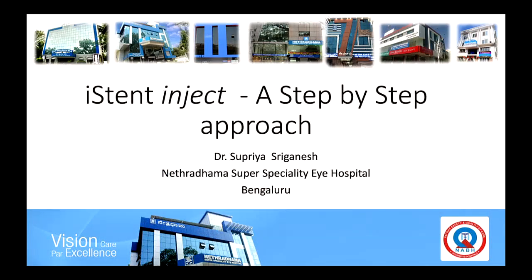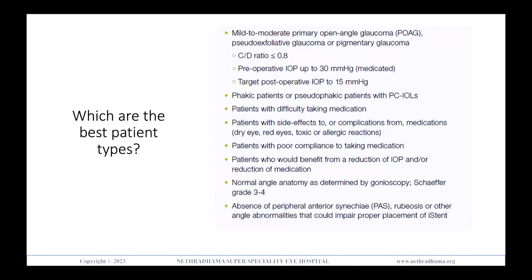Good evening, everyone. Thank you for the opportunity to be here and present the talk on behalf of Dr. Sri Ganesh. This is about the iStent inject, and it's a step-by-step approach to this device and this technique. So first of all, patient selection. Which are the best types of patients to select to undergo this procedure?